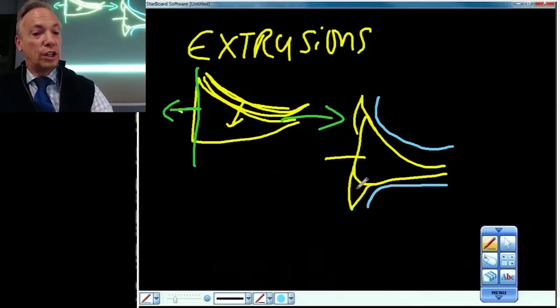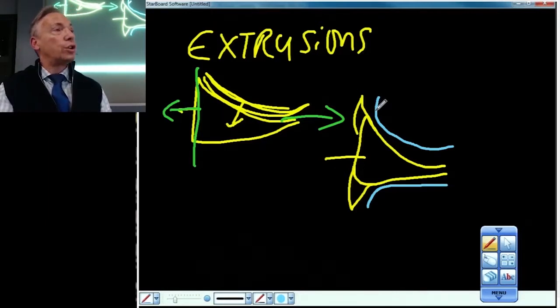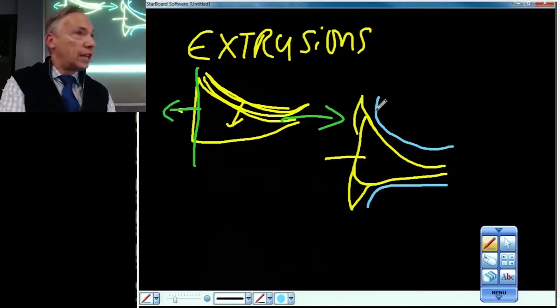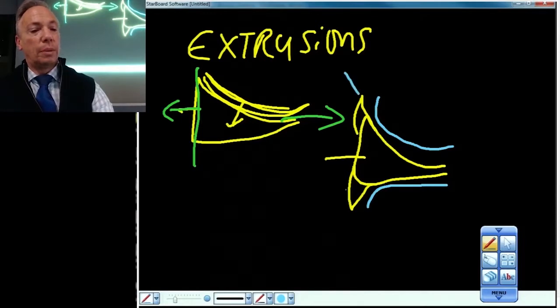Now the meniscus is starting to prolapse along the free edge of the tibia or the free edge of the femur. In that scenario, I'll use the term extrusion of the meniscus, or displacement slash extrusion of the meniscus, in the parafemoral or the paratibial gutter.